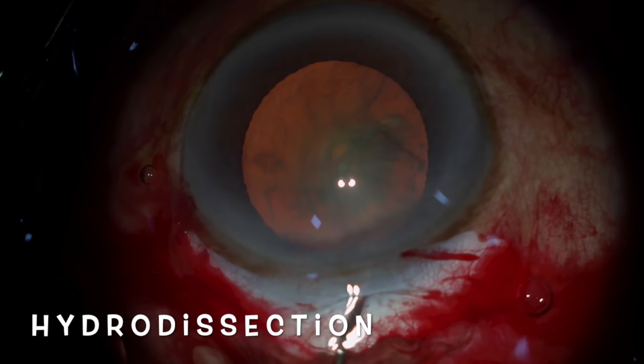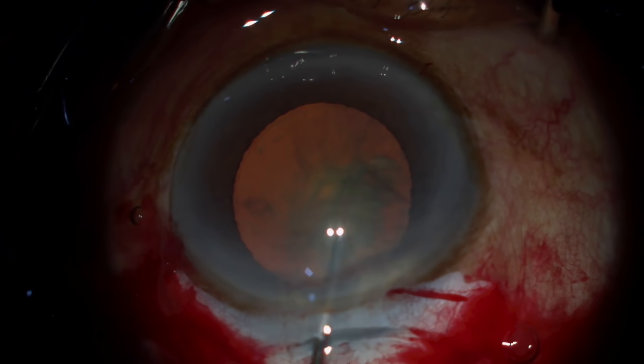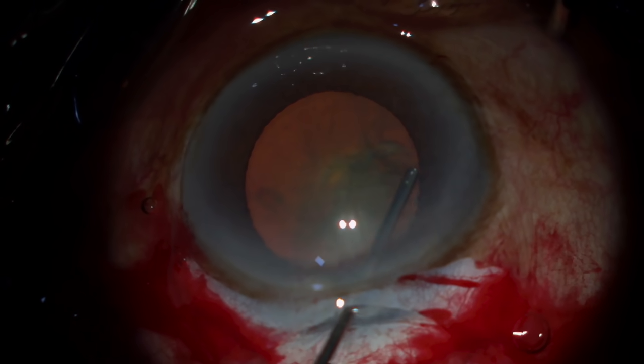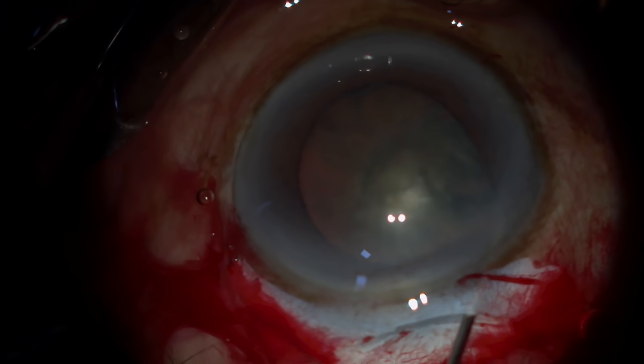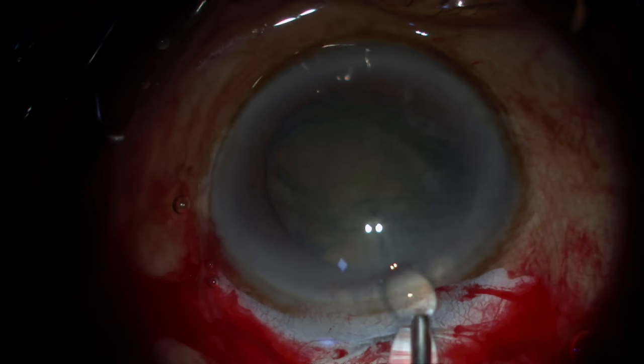Once the rhexis is done, inject some saline in the anterior chamber to bring out the visco. Go under the anterior lens capsule, lift, and start injecting — you will see a wave. When you see a wave, give an extra push so that one pole prolapses out.